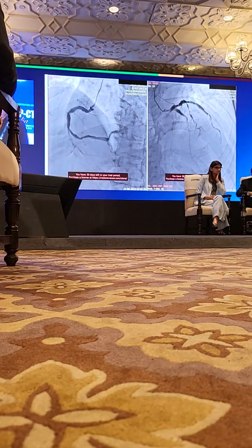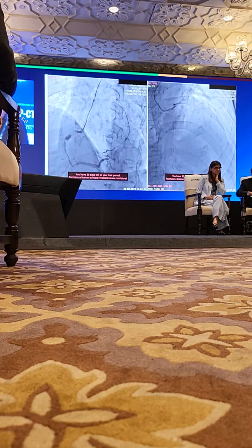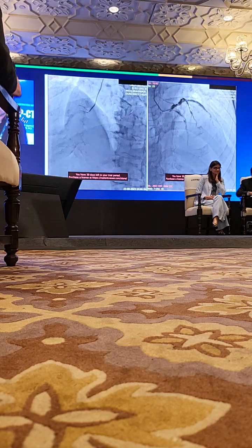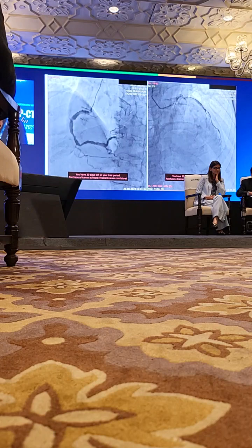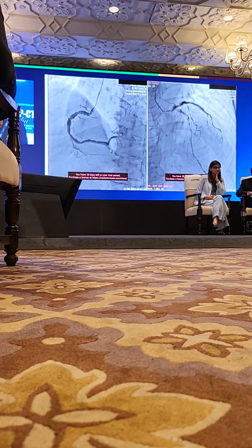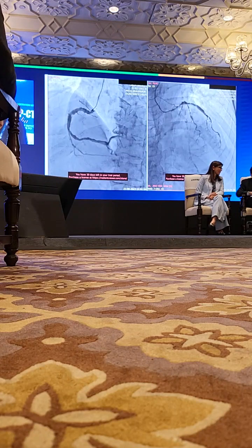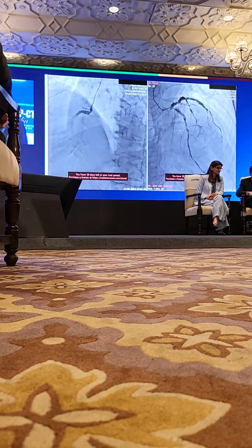Then we went again, and finally we were able to do the angiography, and this was the condition of the coronary arteries in this patient. Mind you, he was a chronic smoker and a hypertensive patient but not on regular medications. After seeing this appearance on angio, we gave the patient the option of medical therapy and continued conservatively, because even stenting would not be advised looking at the coronaries.